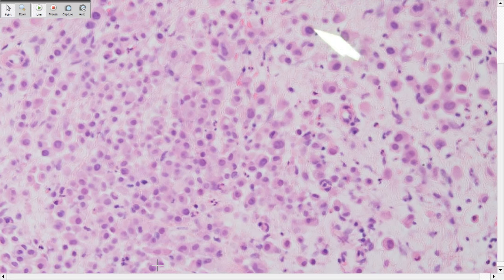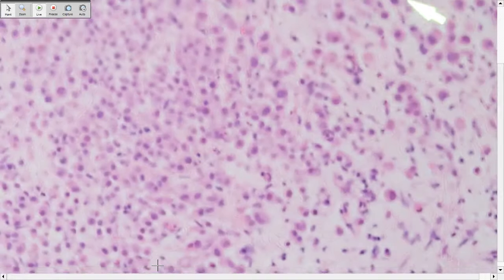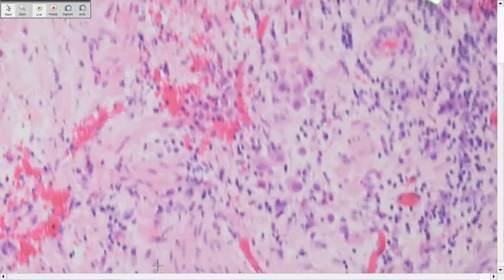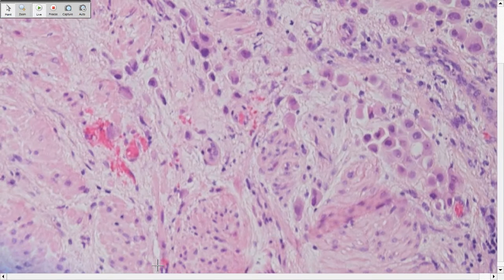Like the features, yes. Be careful. Remember I showed you the kids last year; I thought it was plasmacytoid until I read the pathology outline, and the major differential is breast. I went back and did all the breast markers. It's so scary. Basically, we found the patient had a breast carcinoma removed, probably lobular.